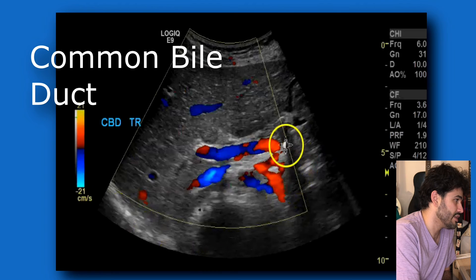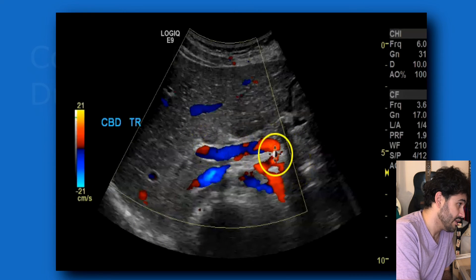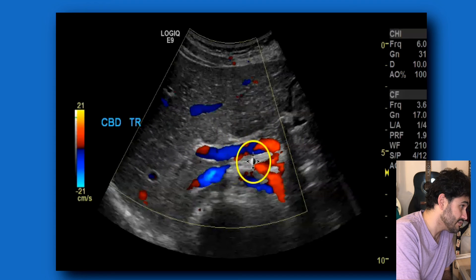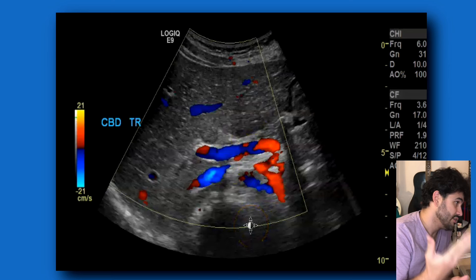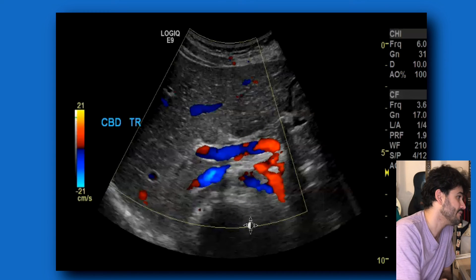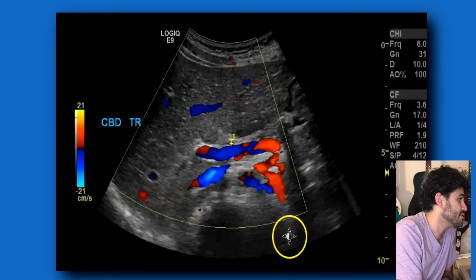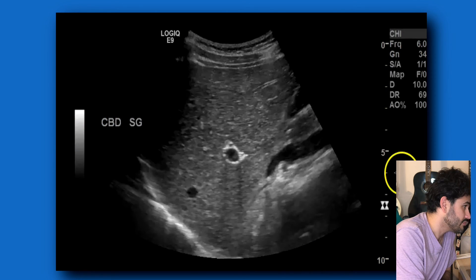In the CBD view, you've got the porta hepatis going into the liver, and your CBD is going to be right above that — so it's the portal vein, hepatic artery, and CBD. Put color Doppler on to differentiate between the hepatic artery and the portal vein. Take that picture, then measure. This one measures 0.2 centimeters. Right there you've got your portal triad again.